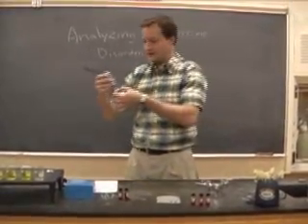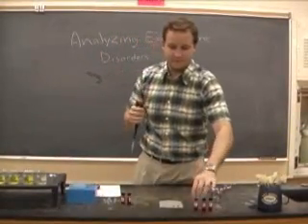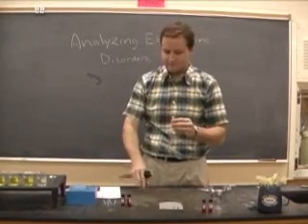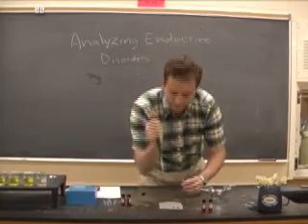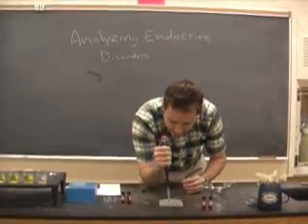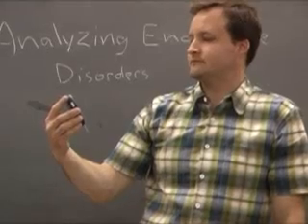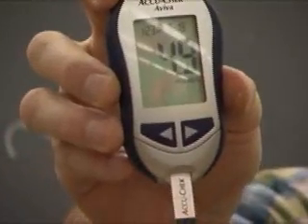Okay, let's move on to sample C. Put it right beside A and B. And dip it in. There we are.